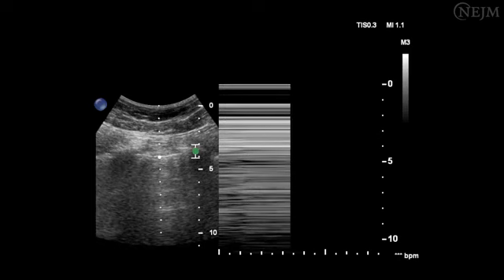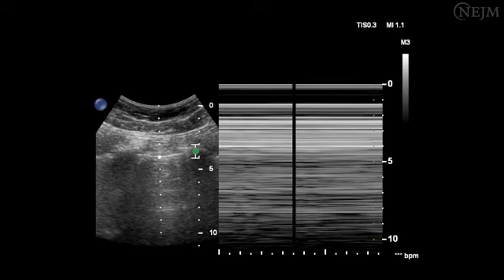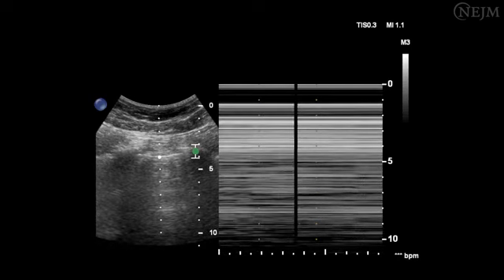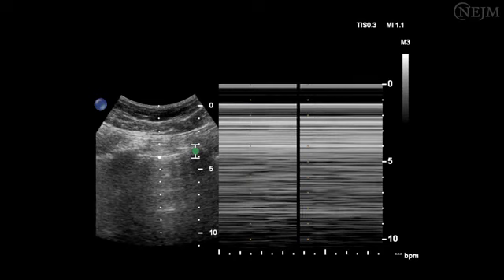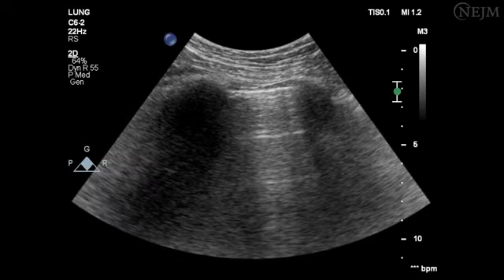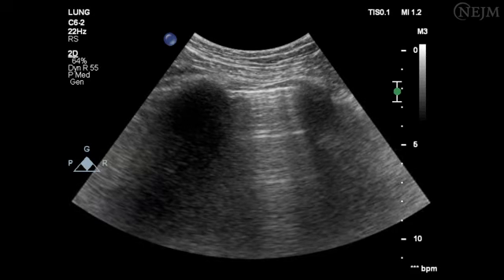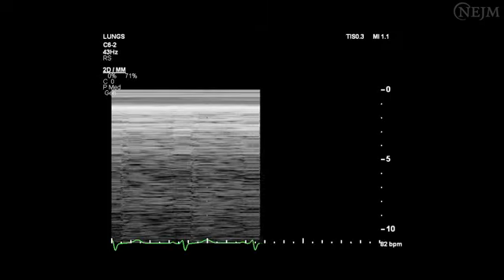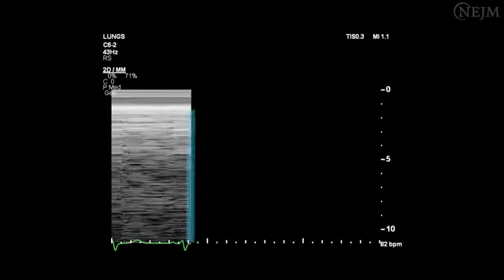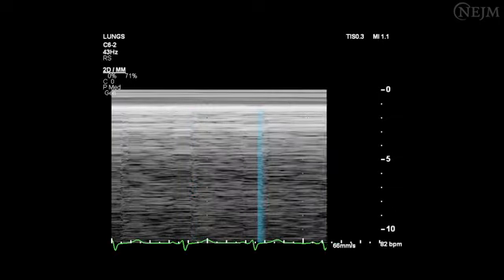When the lung is collapsed as a result of air in the pleural cavity, ultrasound waves are reflected and no movement of the chest structures is visualized. These effects result in a static image known as the barcode or stratosphere sign. In cases of diminished lung sliding with an inconclusive M mode pattern, it may be useful to investigate the presence of the so-called lung pulse. Lung pulse is a vertical artifact that results from the transmission of heartbeats to the lung. The artifacts reach the pleural line but never cross it.